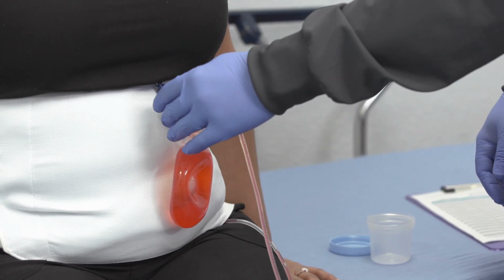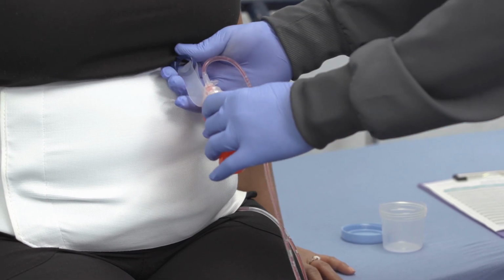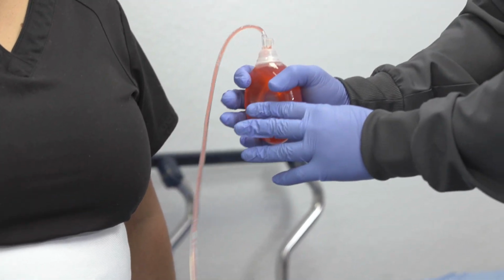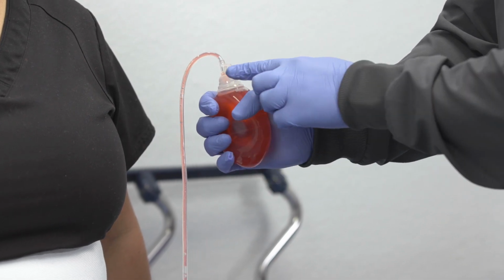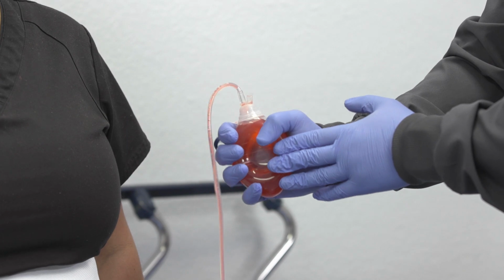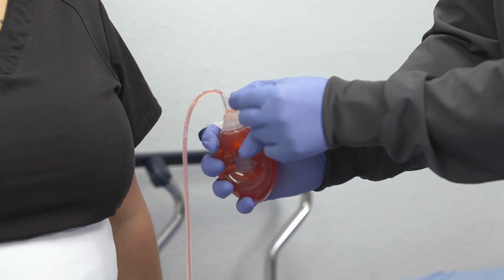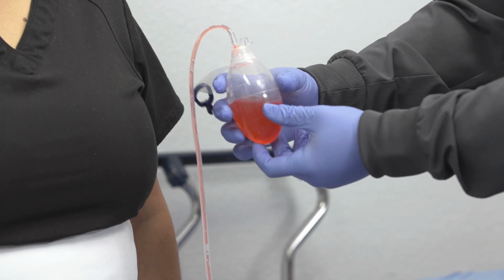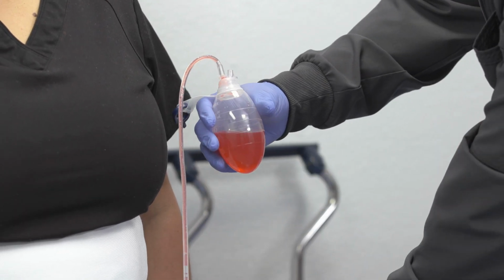After you have completed milking it, you will then unclip the bulb from the patient. You will then hold the bulb lightly. Don't squeeze on it, because when you take the top off, if you are squeezing too hard, it will squirt out. So you're going to hold the bulb lightly. You will then take the top off. You will notice it decompress, if it is not already decompressed, from the amount of fluid in the bulb.